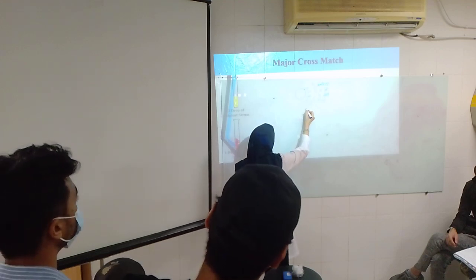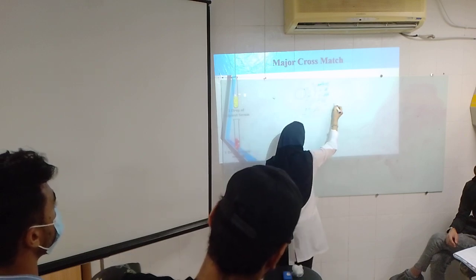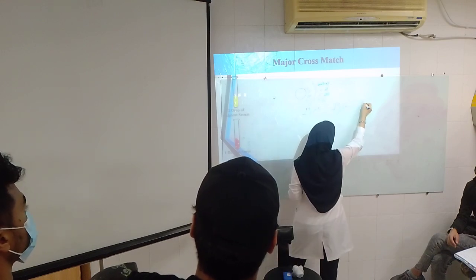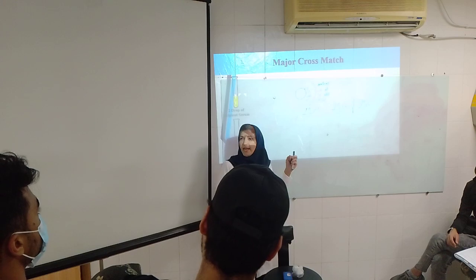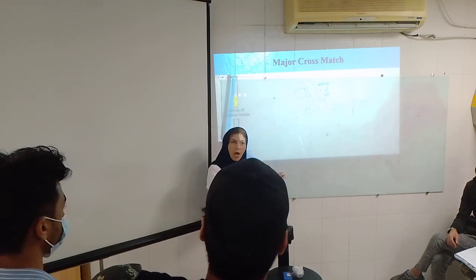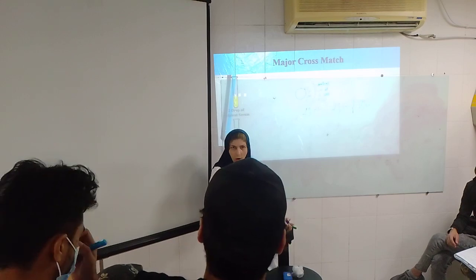Can you tell me unexpected antibody? Something like IgM, complete IgG, incomplete IgG. We have two kinds of IgG. They are unexpected antibodies that you cannot detect by direct and indirect method, even by anti-D factor in RH.